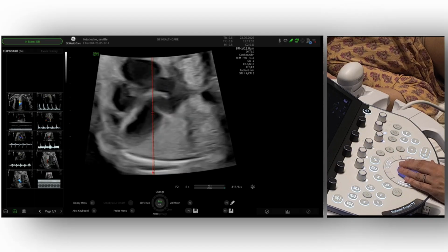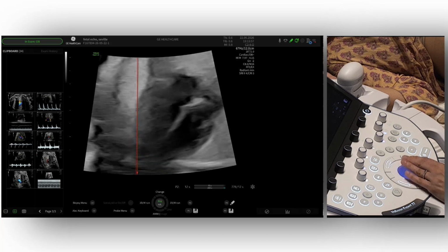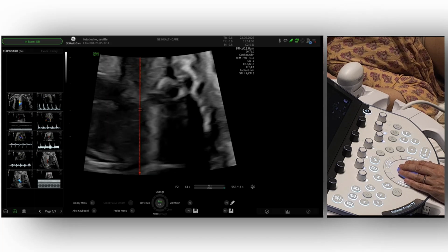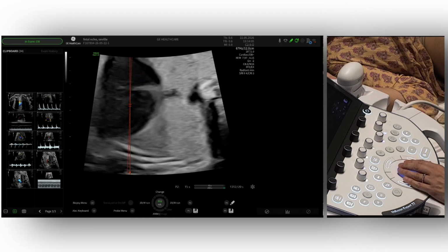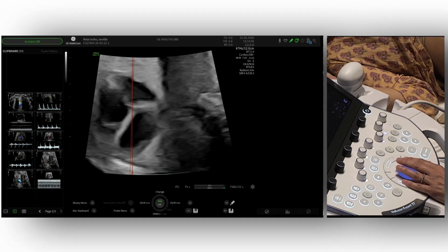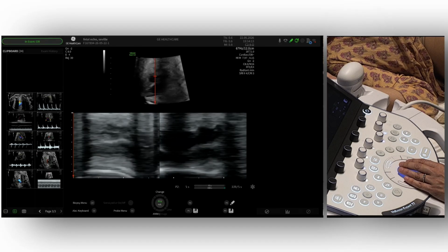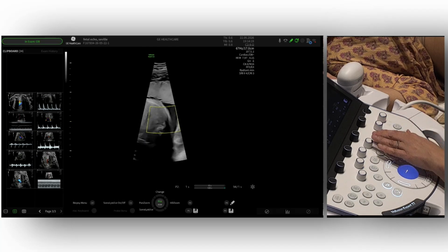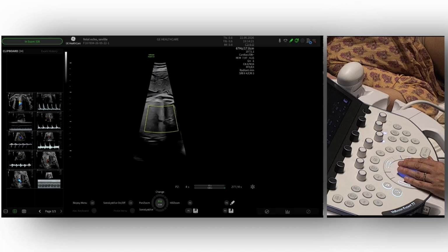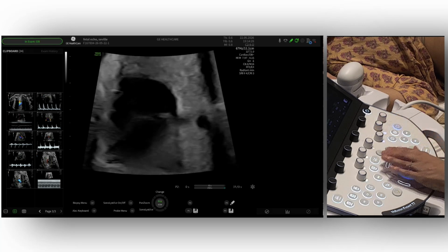Let's see if the baby stays a bit quiet. No. Where are you? It's a very happy baby, moving a lot. Okay, let's try again and see if it can keep still for a while. I don't know, Simon, if there is any question or comment in the meantime.